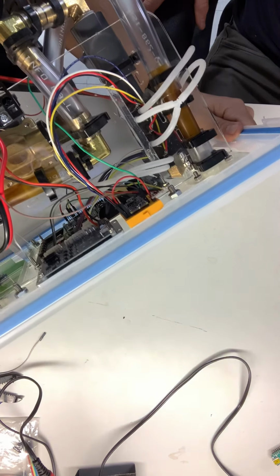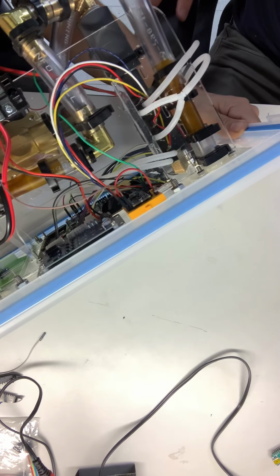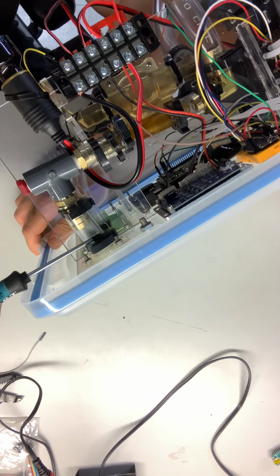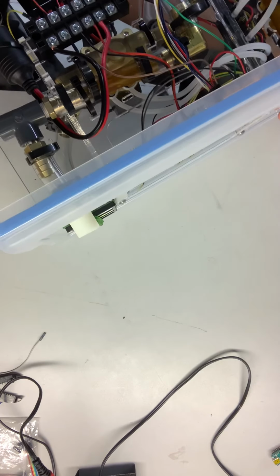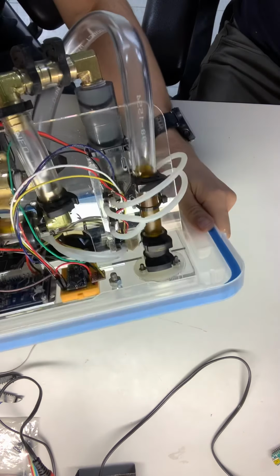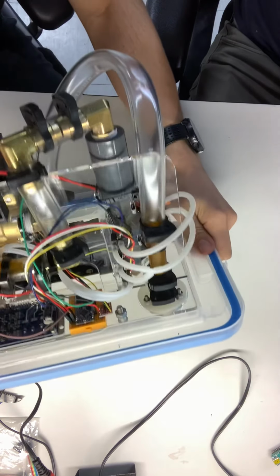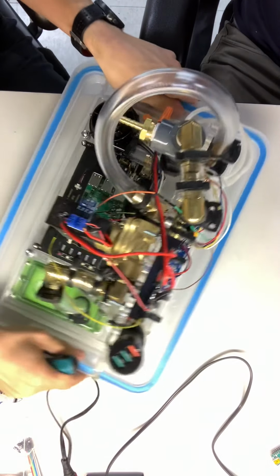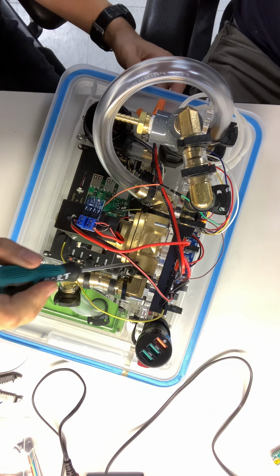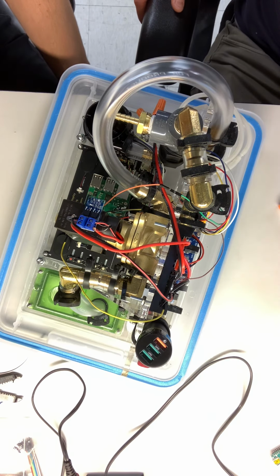So that goes down to the patient venturi, from the patient venturi to the pressure relief tee. So the pressure relief valve to the patient side tubing connection on the faceplate, and then from the patient tubing connection on the exhaust side, we come to the patient venturi on the exhale side, tubing to the intake to the solenoid, which is in the correct direction for the check valve in there, to the tubing connection to the exhale, and that's the pneumatic circuit.